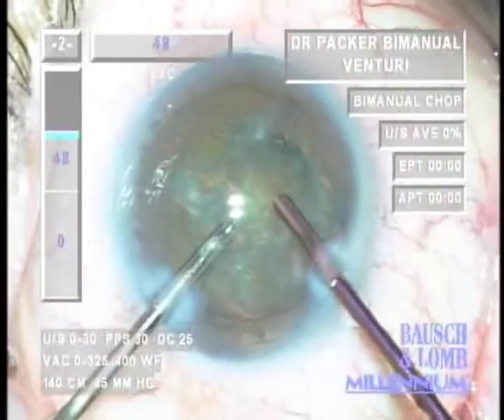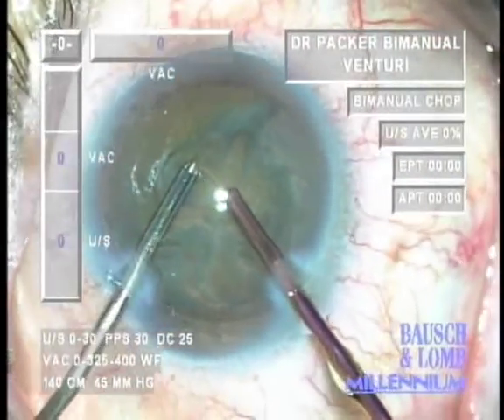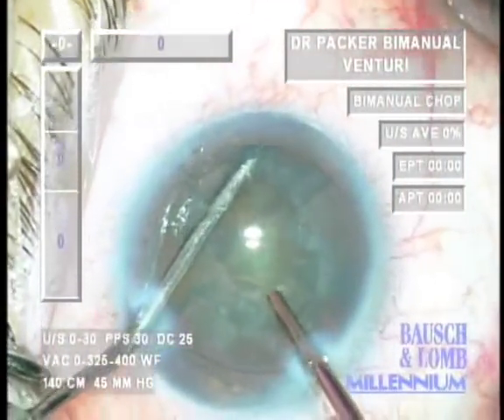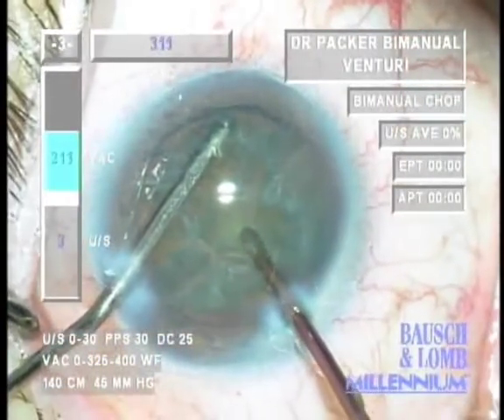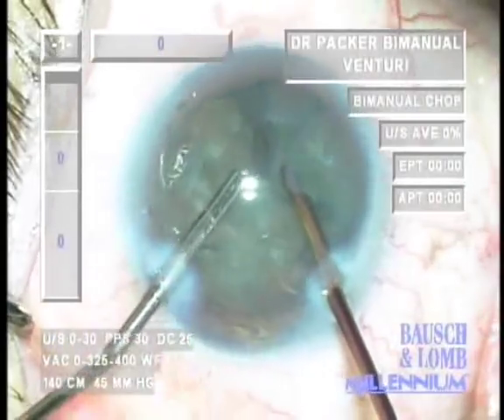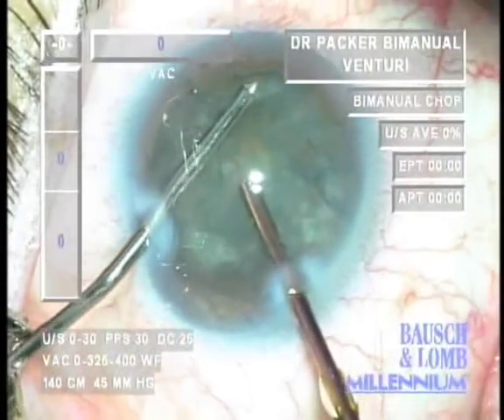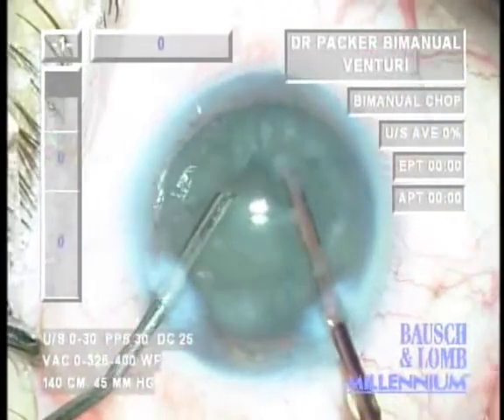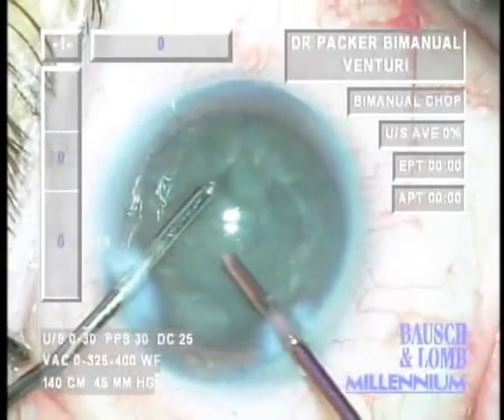This instrumentation for 700-micron FACO was developed by Microsurgical Technologies. A horizontal irrigating chopper is used in the left hand with a standard horizontal chop technique as originally described. The 700-micron tip is buried centrally in the nucleus, vacuum builds, and the nucleus is fractured into two pieces. In this case they are asymmetric — the cleavage plane was not directly through the center of the lens, but that is not a problem. The larger segment is addressed first, horizontally chopped and drawn centrally for aspiration.